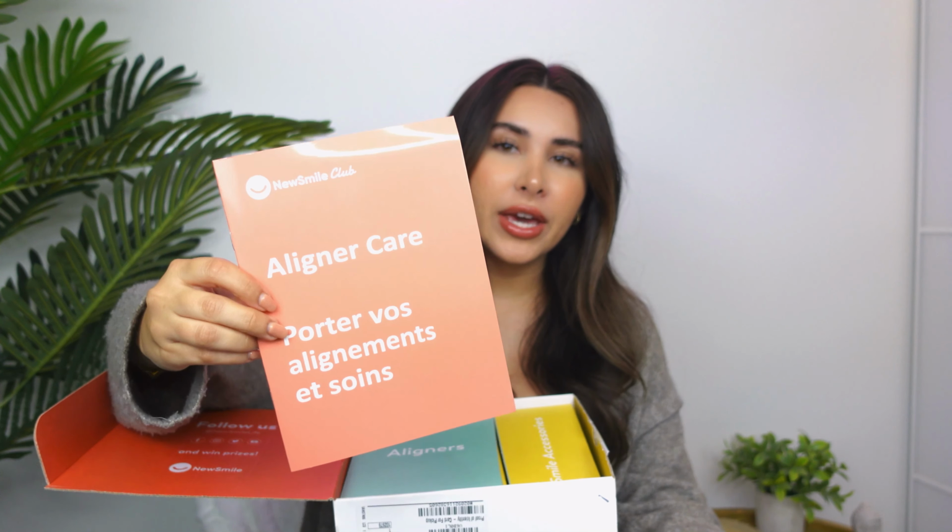This is the aligner care. So again, I'm not going to give you details about everything because you can go and watch my last video and you'll get so many more details. But basically, general care for your aligners would be don't use toothpaste. I said that on the last one, and then I did end up asking the team and they said don't use toothpaste, just the brush and water and clean it and it'll be clean. And actually I do that now all the time and I have no problems. They don't smell or anything. Just give them a good brush, not with toothpaste.